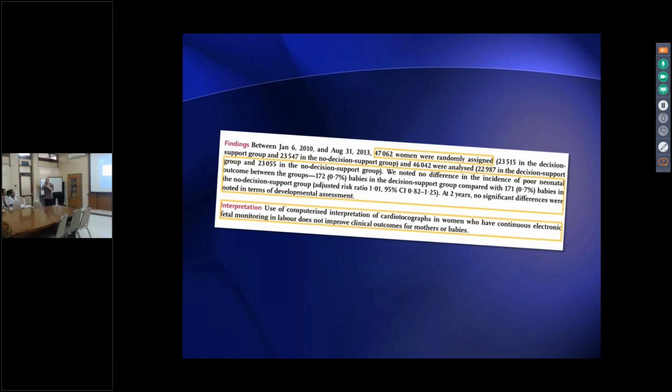One of the criticisms that I have of any CTG categorization system that I'm aware of, or classification system, is most categorization systems that I'm aware of internationally do not include uterine contractions as part of the criteria in categorizing the trace. They include baseline fetal heart rate, baseline variability, accelerations and decelerations, but don't include contractions. But yet the CTG is fetal heart rate and contractions combined. We must have both.